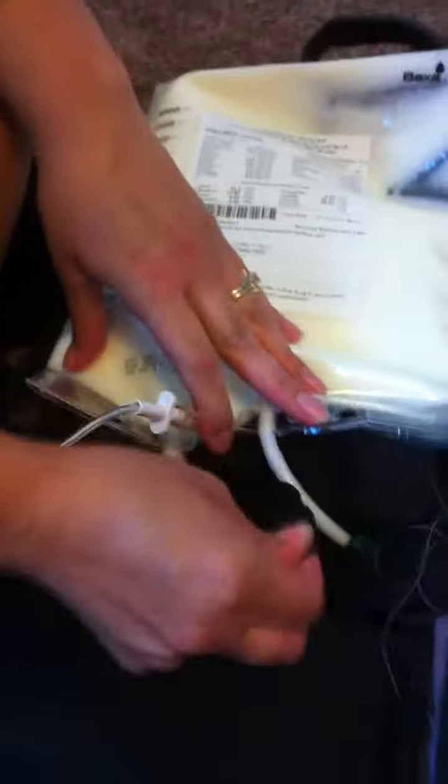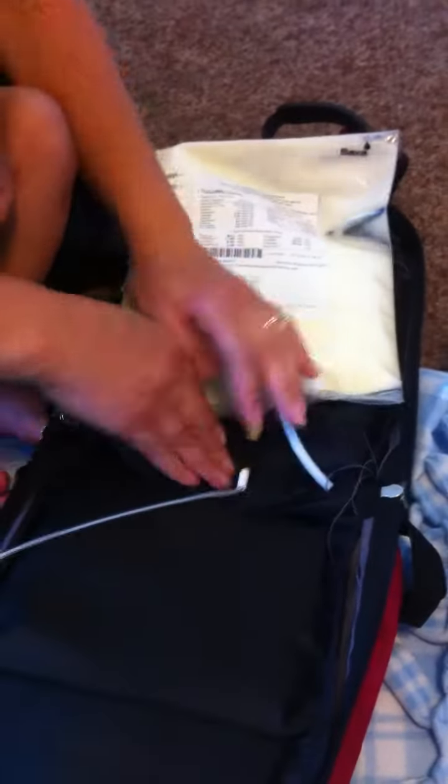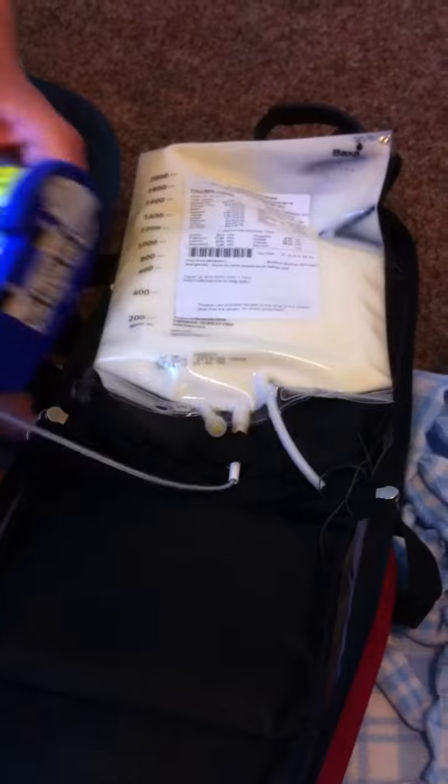Get the tubing in. There's a little hook on the bag — hook it in. Put this in the hole. Throw this little strap over the tubing. Put the pump in sideways like that. Close it and zip it up.